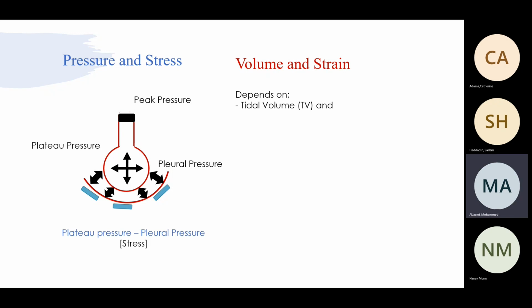Let's say Mahmoud, he has only one lung. 250. That's right. So I don't know. Is that right? Kareem, he has bilateral infiltrates. Hamza, he has ARDS. But I will give you all 500. Despite that, all of you, your FRC is not the same. Is that right?